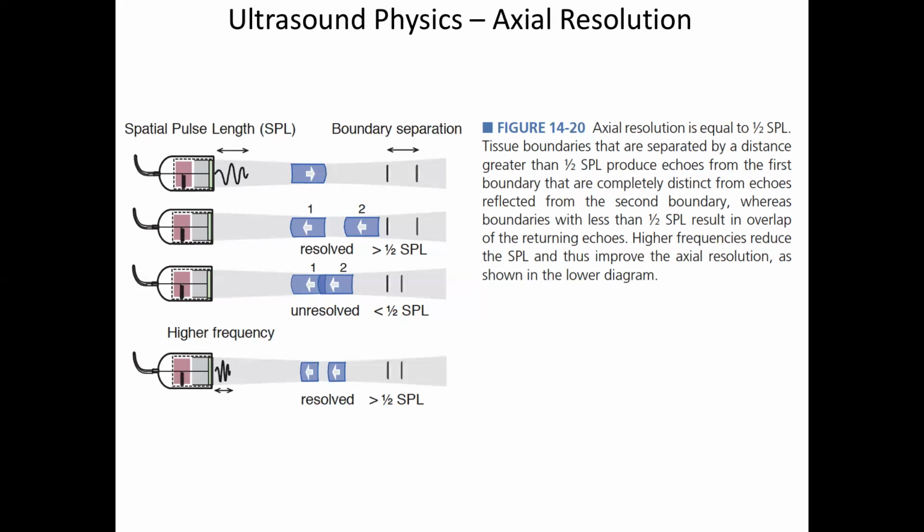We'll take a look at that. In my time in medical imaging, one person's artifact is another person's technique. This distortion of the wave causes artifacts, but it can also be used to your advantage. We'll take a look at that. It's called harmonic imaging.